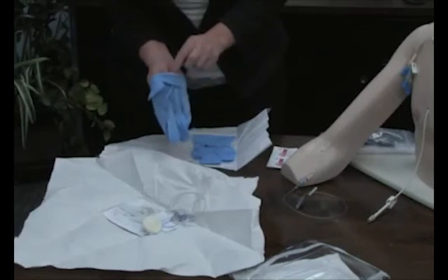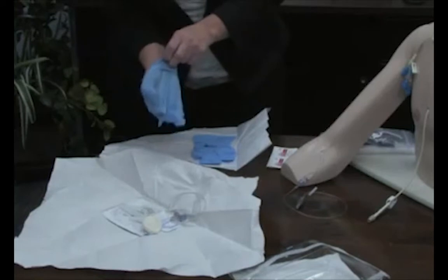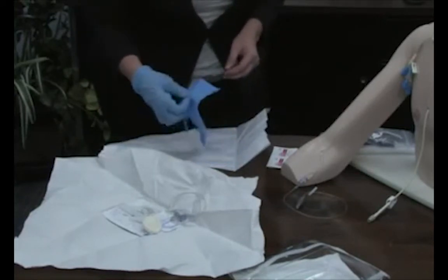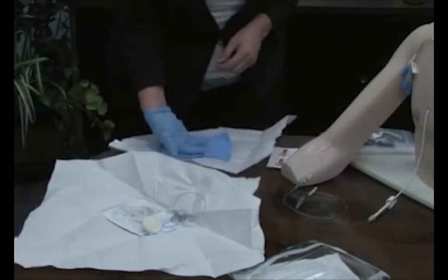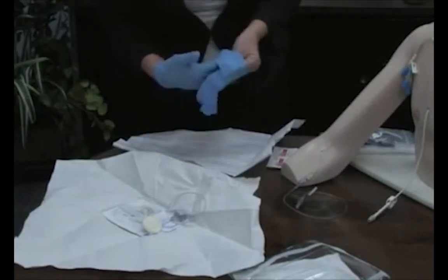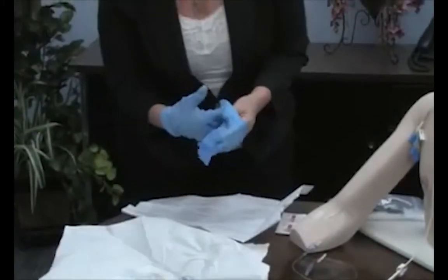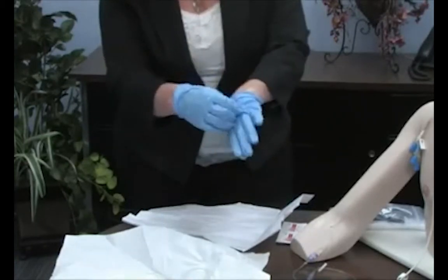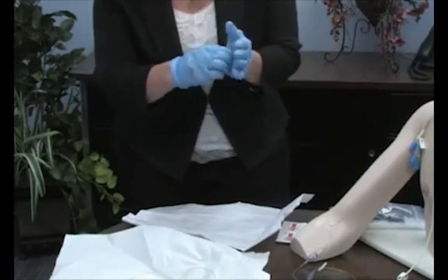So when you're putting on your gloves, there's a cuff there that you can touch with your non-sterile hand to pull it on. And then on the second glove, you use that cuff to put your fingers underneath and slide your non-sterile hand in. And then, as long as you don't touch in the cuff area, you can use this to kind of straighten out the glove.